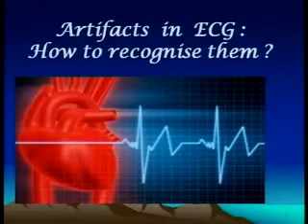As Dr. Jayaprakash has rightly said, the first bedside diagnosis is to identify what is normal and what is abnormal. So is this a normal ECG or is this an abnormal? Can I have that trace? Is this normal or abnormal? Now, once you have picked up an abnormal ECG, you need to find out whether you are dealing with a false positive, because that's very important. Once you have detected there is some abnormality, is this a true abnormality or a false positive?